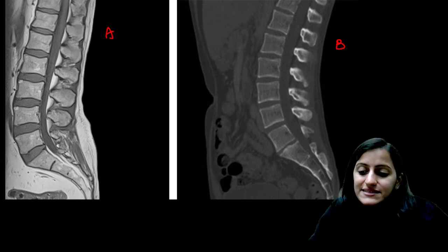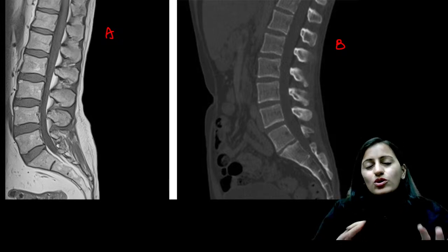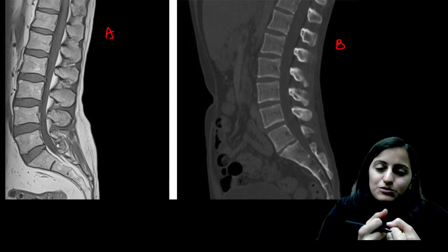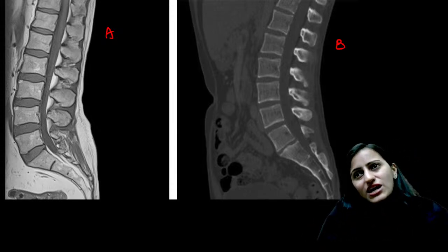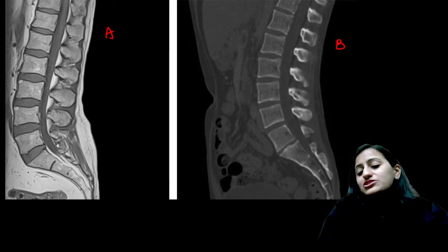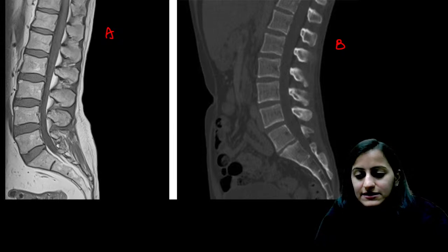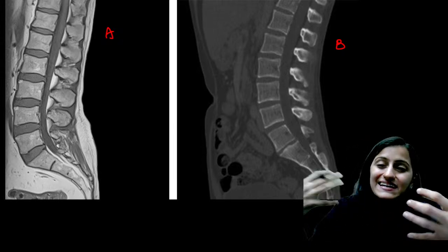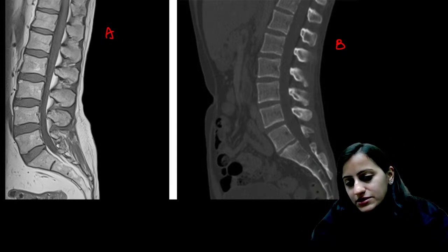What is the HRCT difference? HRCT is high resolution CT. The only difference is the parameters that we are using to take the images. The CT machine is the same. I'll cover HRCT also tomorrow to show you the concept. HRCT is used where you have air surrounded by bone, so in the lungs, temporal bone, and PNS we use it.